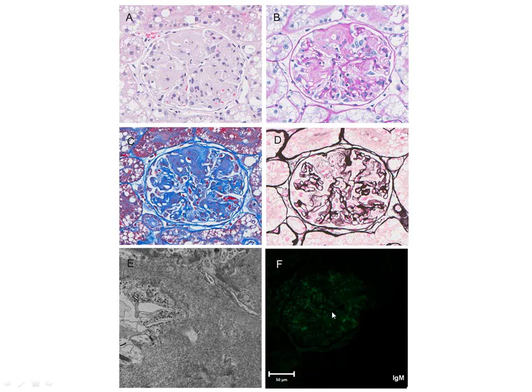I mean, it's not completely negative, but I don't think that this would scream positive for immune complex, my IF. Yep, exactly. And this is the issue of whether this would be, so this is more of a lifestyle thing or like a life lesson that you're always going to see a little bit of hazy green. So that's like a life lesson.